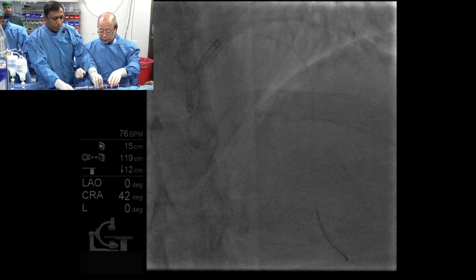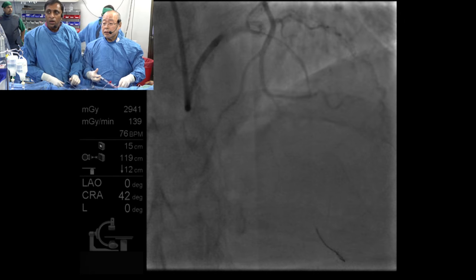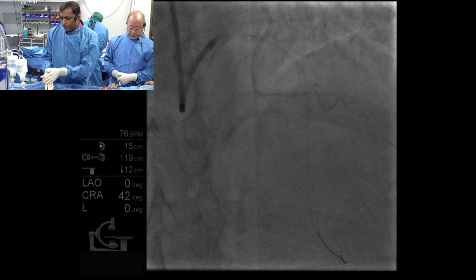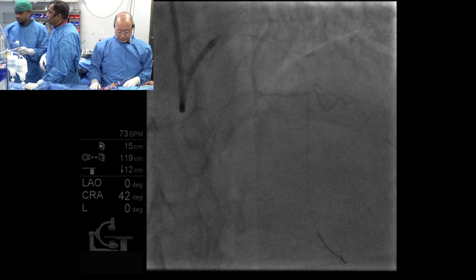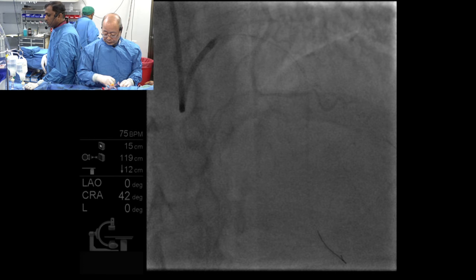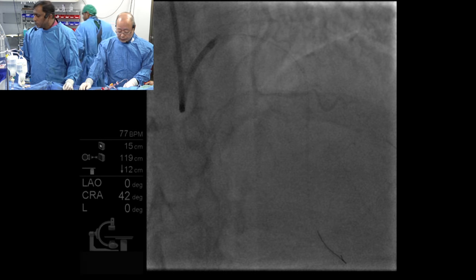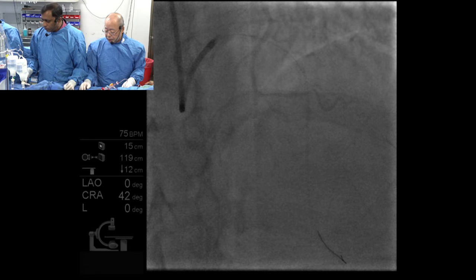I think a more important comment is that being familiar with some type of wires is more important than which one we are going to select here. If you are more familiar with that type of escalation, I would stick to it rather than start to try new devices. We do have new wires every year, one or two every year, so trying to be familiar and proficient in all the different wires is probably not going to be a good thing.